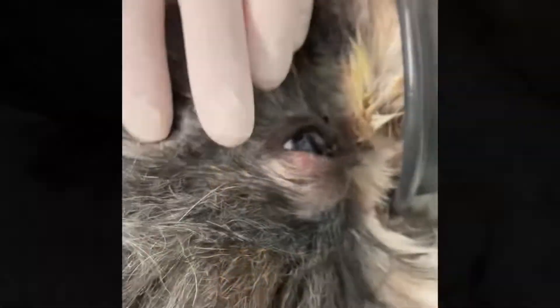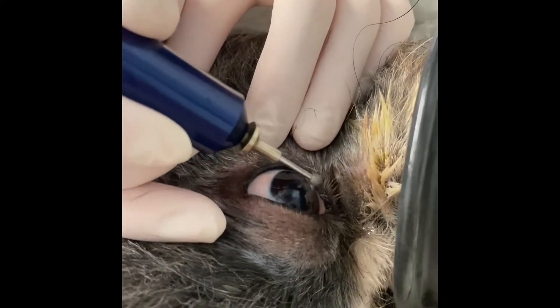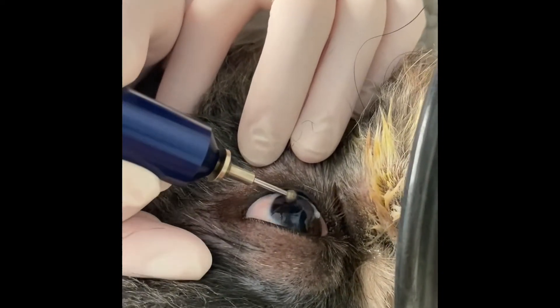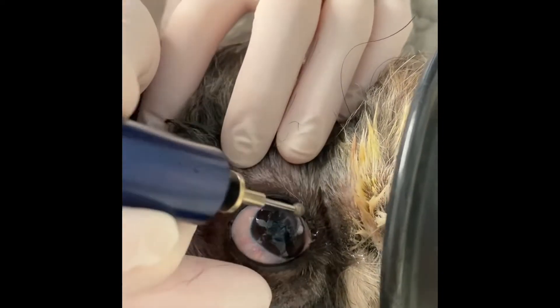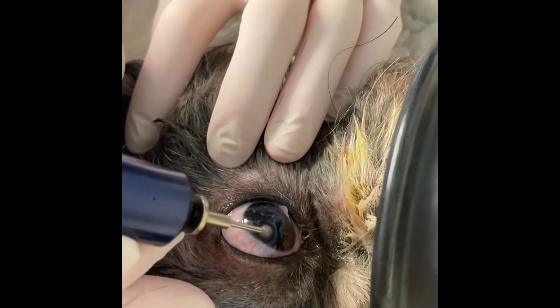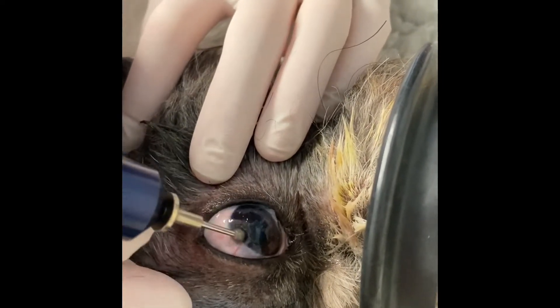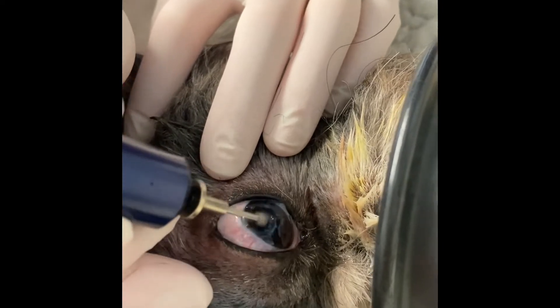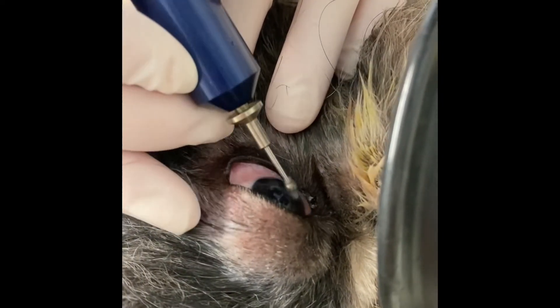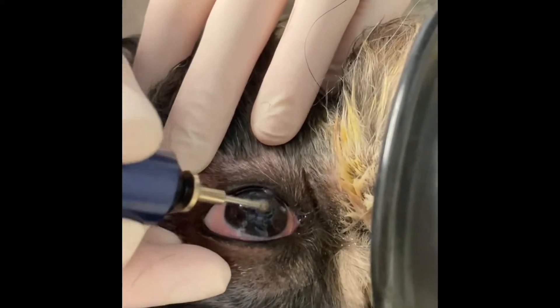You'll start off by adequately cleaning the eye with a diluted povidone-iodine solution, approximately 1 in 50, cleaning both on the corneal surface and briefly in the surrounding tissues, and then using a rotating Diamond Burr tip on a battery-operated handheld device that will gently lift up the epithelial surface on these indolent ulcers.